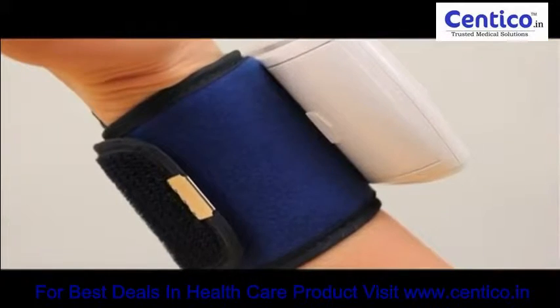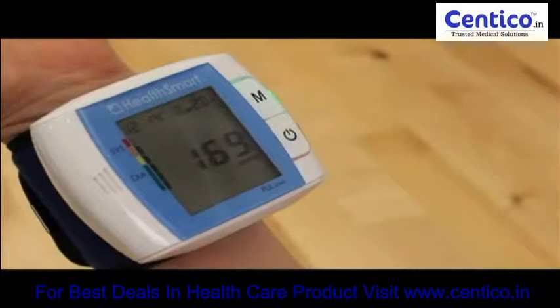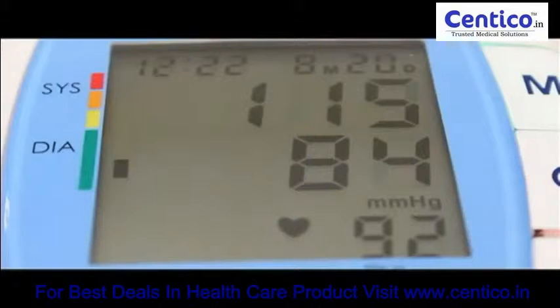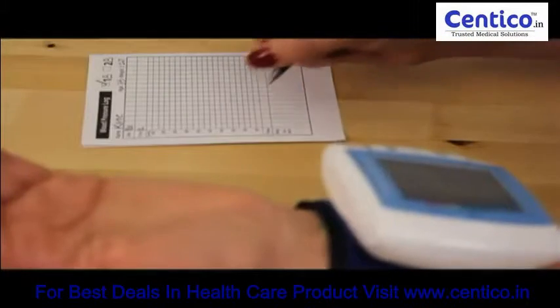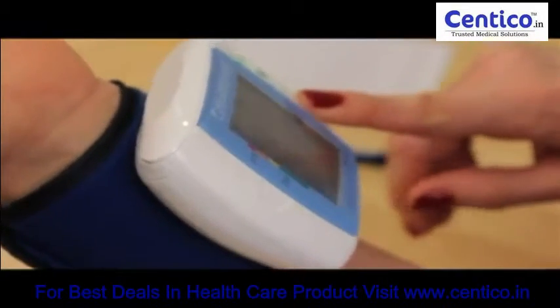The cuff will automatically inflate. Do not move and remain quiet during the process. The cuff will rapidly deflate and your systolic, diastolic, and pulse readings will appear on the screen. Record your readings in a chart. Press the power button to turn the unit off.